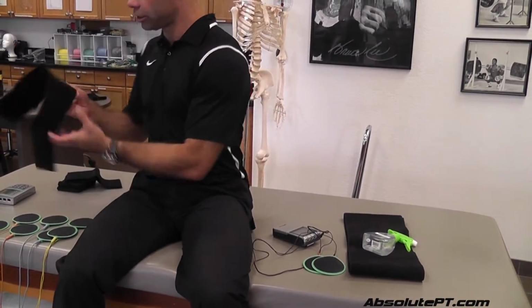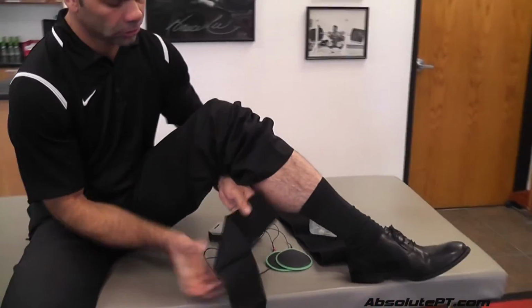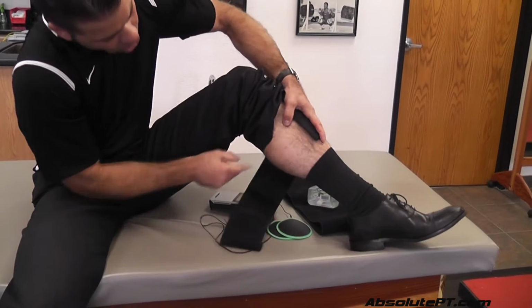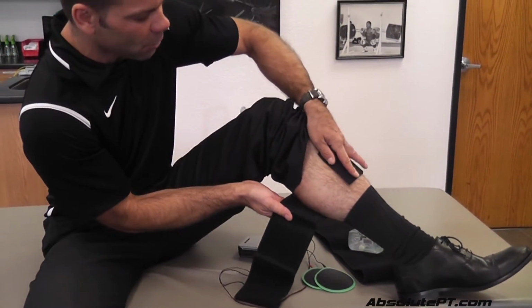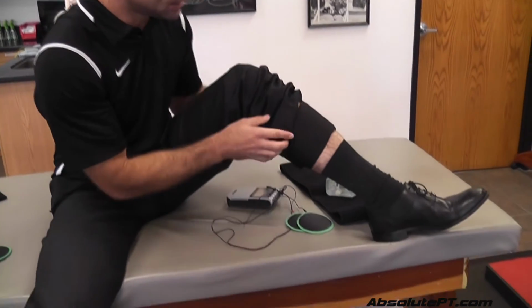And so then I'll use a strap. I use the furry side in, Velcro side out, such that I can just, oh, that's an electrical burn from trying a different brand of stimulator that's not biphasic. It was monophasic. I don't like monophasic stim. Okay, so that's an aside.